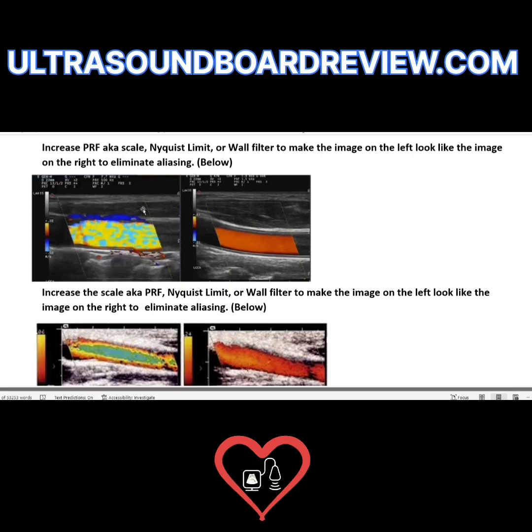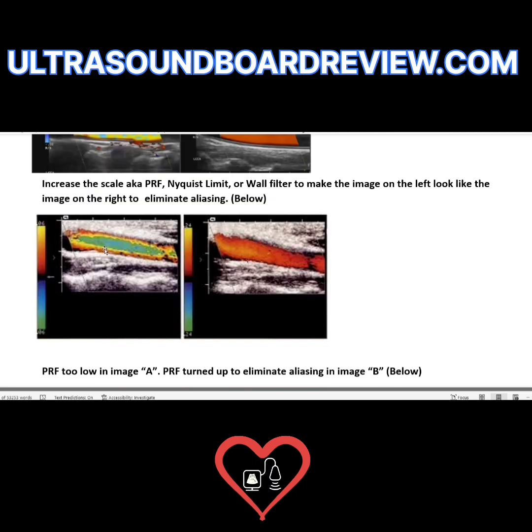To fix this, you increase your PRF, scale, Nyquist limit, and wall filter. This other image also represents aliasing, and to fix it you again increase your PRF, Nyquist limit, wall filter, and scale. When you adjust your scale, you're also adjusting your PRF, Nyquist limit, and even your wall filter.